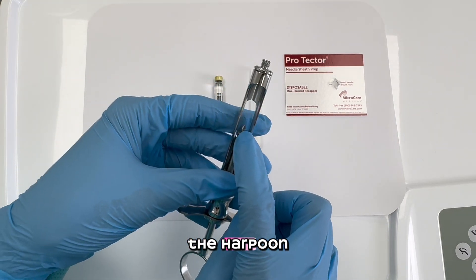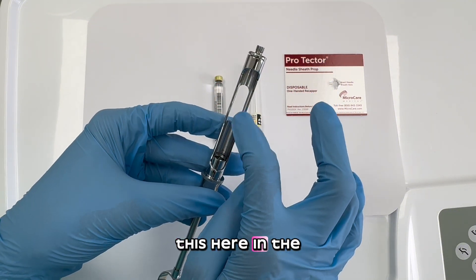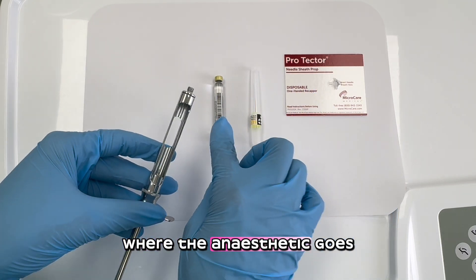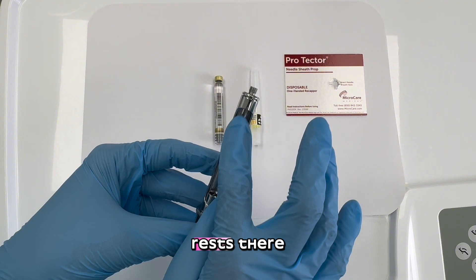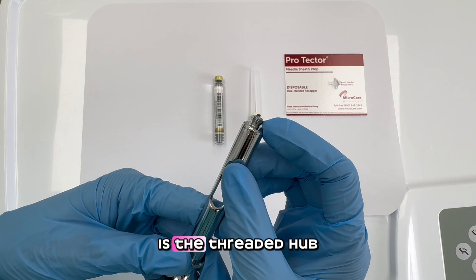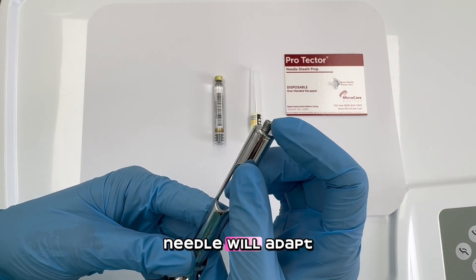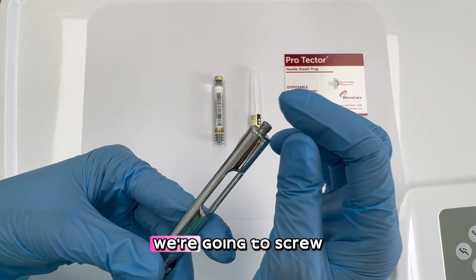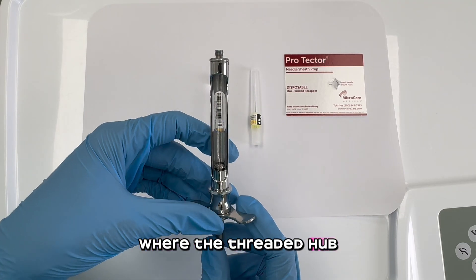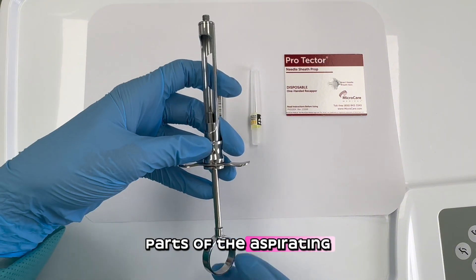So we have the harpoon with the piston. This here in the center is the barrel hole, where the anesthetic rests. Over here is the threaded hub, where the needle will attach — we're going to screw in the needle at the threaded hub. So these are the parts of the aspirating syringe.